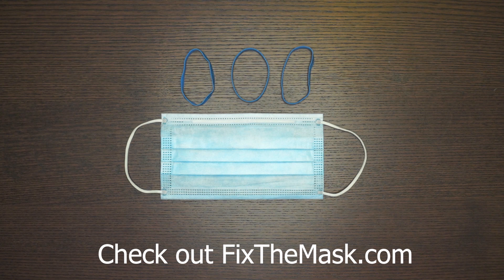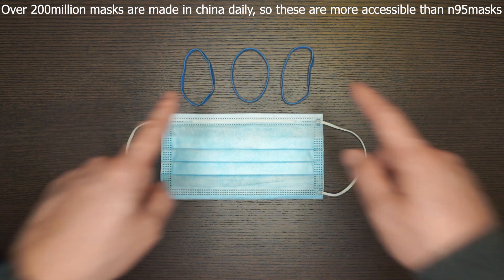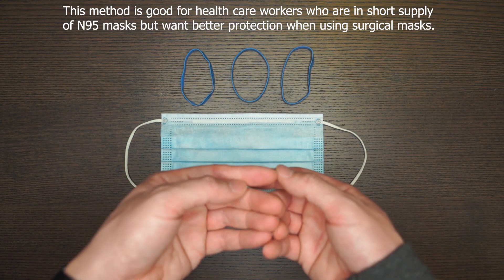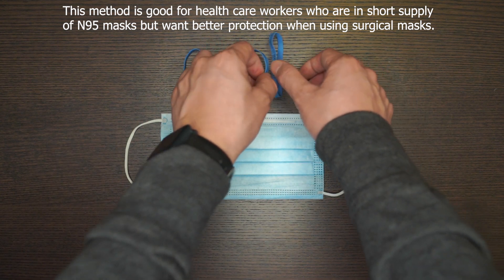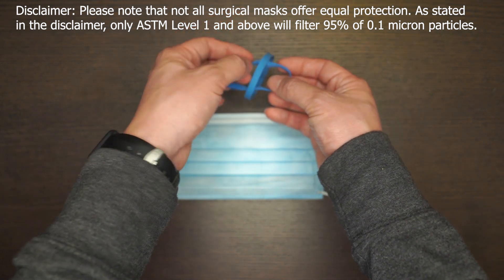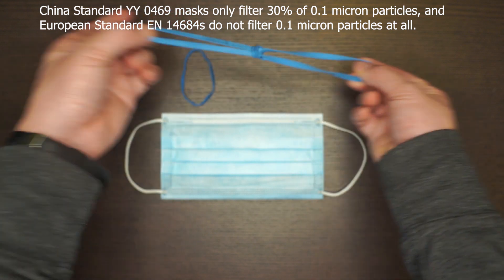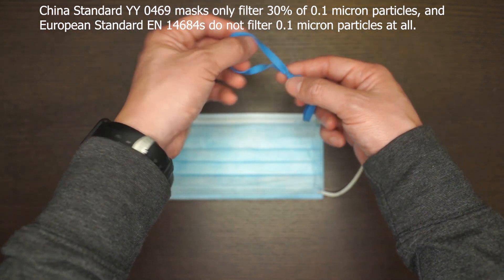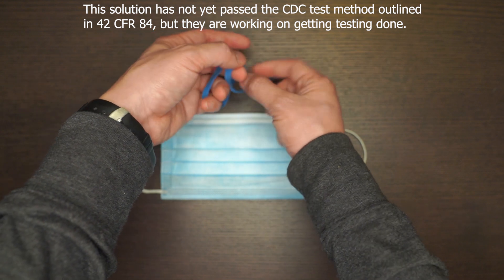This team at FixTheMask.com created this DIY method so that you're able to do it at home by using three rubber bands and tying them together to create those breaks around the mouth. What you do is get two of the rubber bands, loop them, and make a knot by doing this — and you do that similarly to the other side, like so.